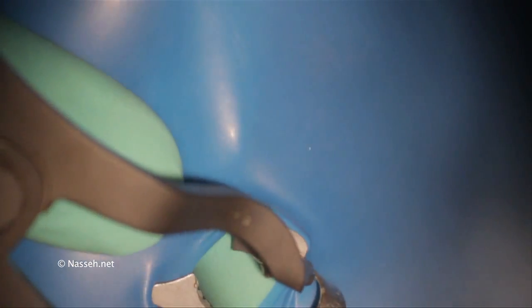Oftentimes a single hole is made into a rubber dam and the tooth is isolated individually. However, when the tooth cannot be isolated with a clamp or cannot be clamped, a split dam technique is used in which the tooth distal to the tooth in question is clamped and the rubber dam is pulled over that tooth and the tooth in front of it.